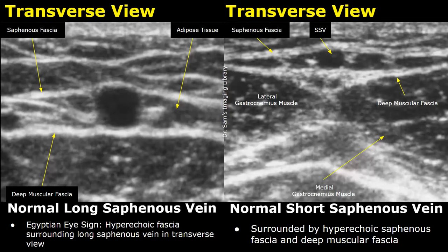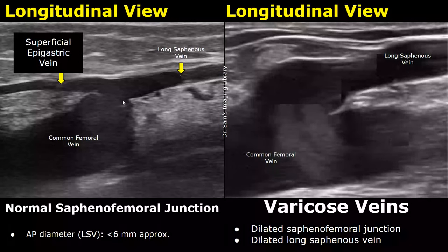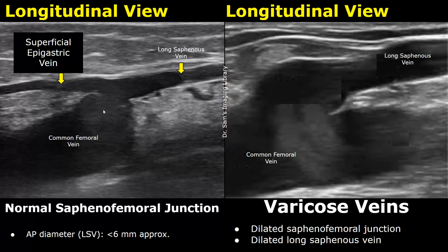Here is a longitudinal view showing the saphenofemoral junction. This right here is the superficial epigastric vein. The normal AP diameter of the long saphenous vein is usually less than six millimeters approximately. This is the long saphenous vein — it joins the common femoral vein at the saphenofemoral junction.